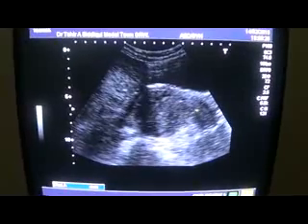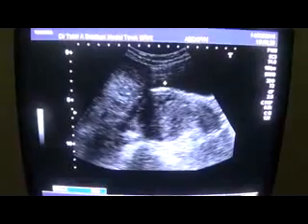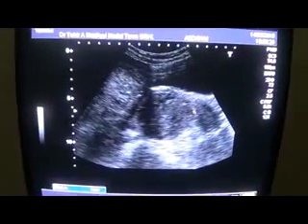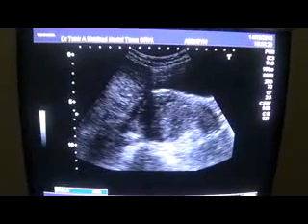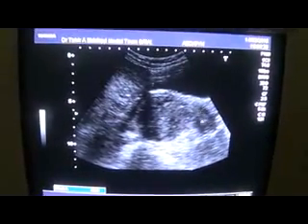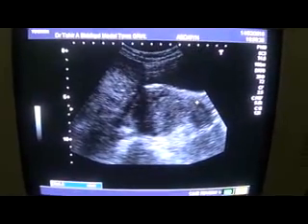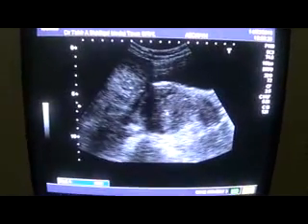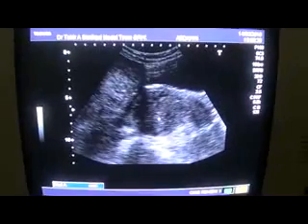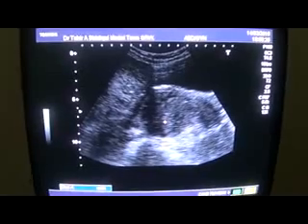Now here I have frozen this image to show you the urinary bladder in longitudinal section. This is the longitudinal section of the uterus. This is the cervix, and this area is the cervical canal. And this is the endometrial canal. It's retroverted. It is in fact a retroverted uterus. The endometrial canal is taking a turn downwards posteriorly.